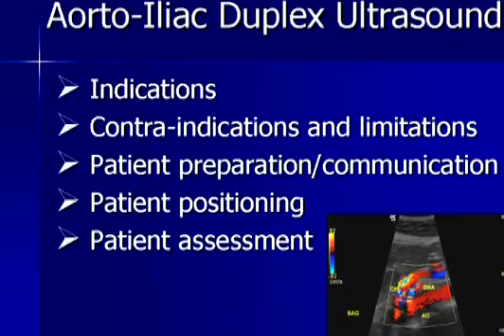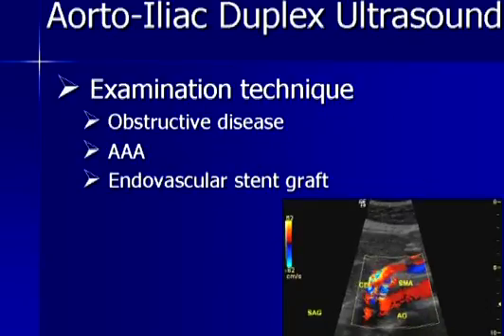We're going to talk about a number of topics today. I just want to summarize them very briefly before I go into greater detail. We will discuss the indications for these examinations, what contraindications may exist and the limitations of these examinations, patient preparation and patient communication issues, the positioning of your patient, the assessment of your patient.